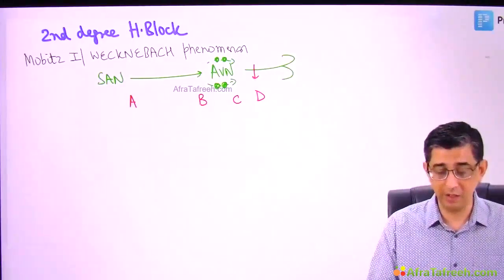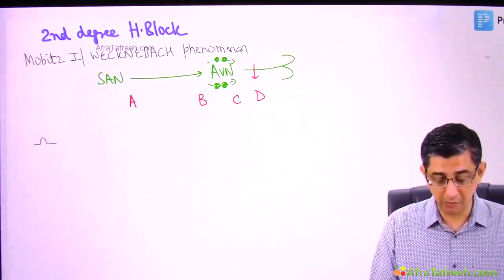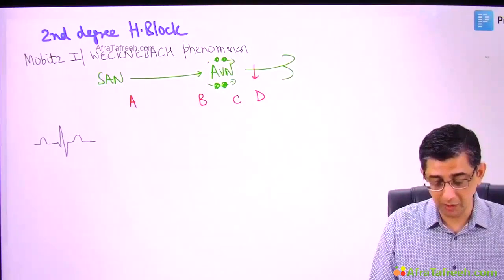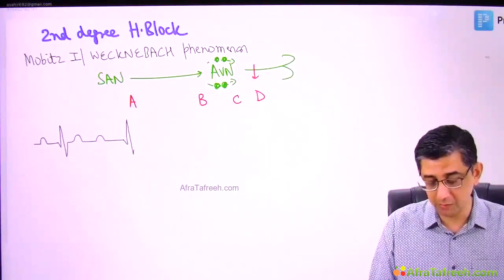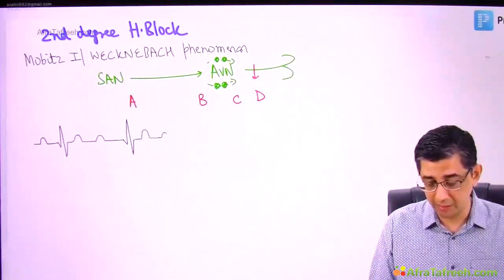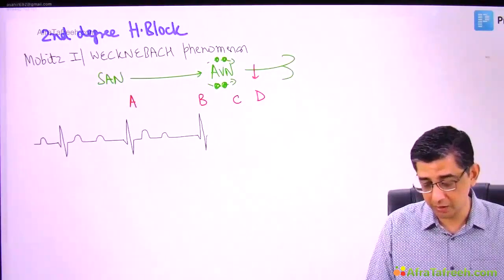Now let us understand how the ECG of this person will evolve. When you scan the ECG from left to right, you will notice a progressive increase in the PR interval of this patient. Please be patient while I hand draw the same before you, because the easiest for me is to show you an ECG, but then lots of time you might miss a couple of facts. So let's try to hand draw this so that we can get a better orientation.